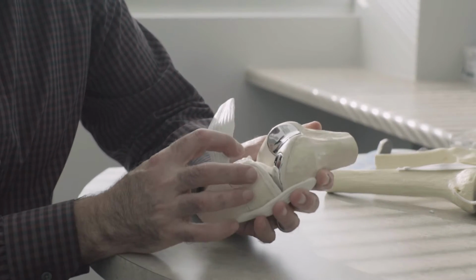Today I'd like to speak with you about joint resurfacing of the knee. Joint resurfacing really falls in two categories. We could do either biologic or prosthetic, and today we're going to focus on the prosthetic resurfacing. Prosthetic resurfacing, as I explain it to patients, is three types. First is inlay resurfacing, second would be an onlay resurfacing, and lastly would be a total knee arthroplasty, or a total knee. So now let's talk about inlay resurfacing.